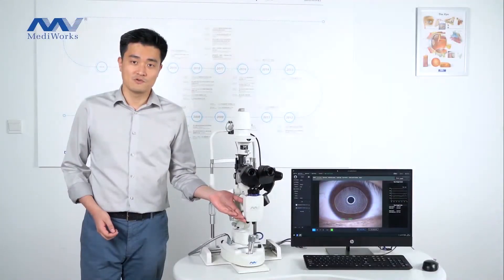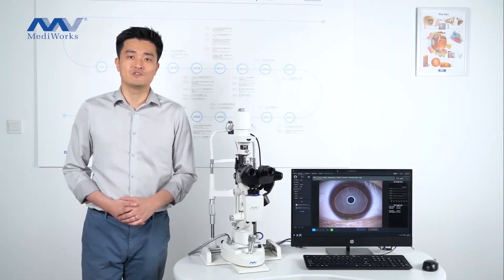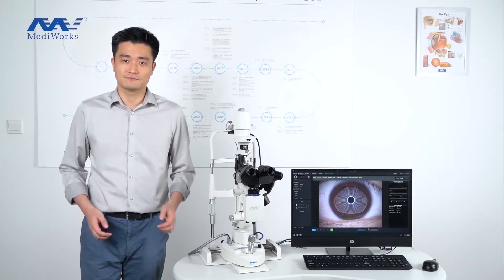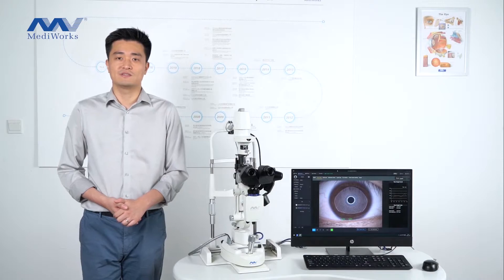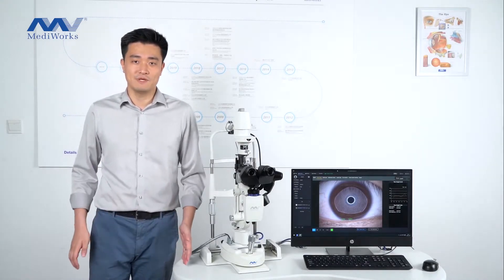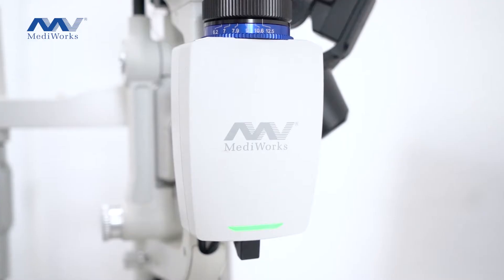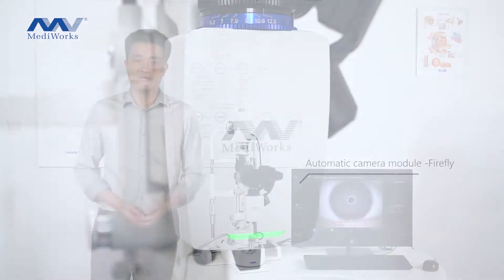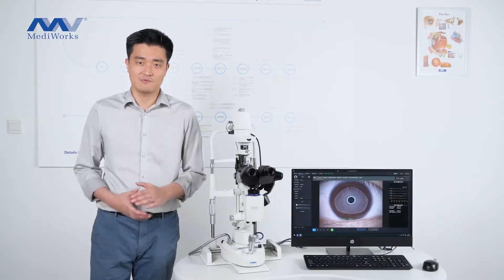The built-in yellow filter helps to offer a better observation for the veins and for the fluorescence images. The camera module provides high resolution images and videos with wide dynamic range. Compared with the traditional camera slit lamp, you don't need to set any parameters, and it has auto-focus and auto-white balance, so it's extremely easy for capturing.